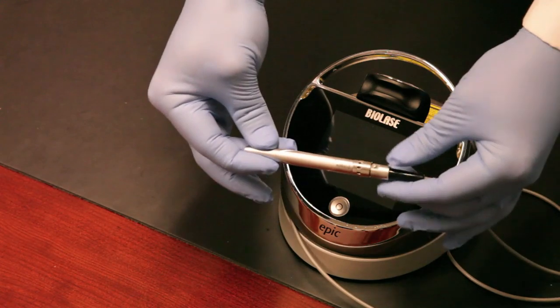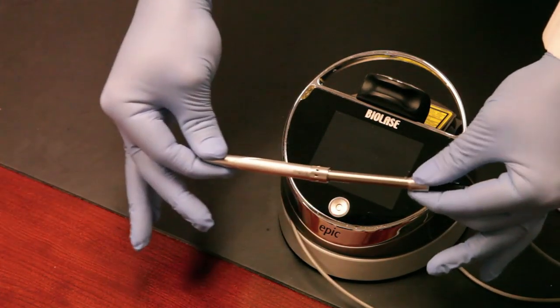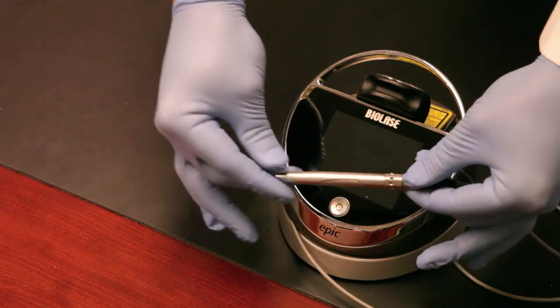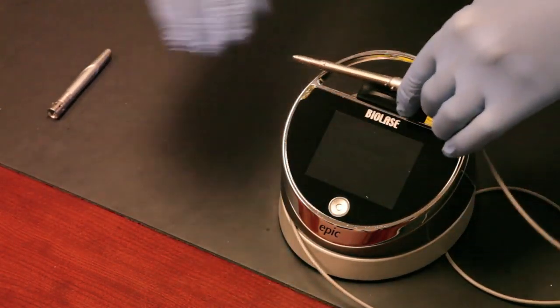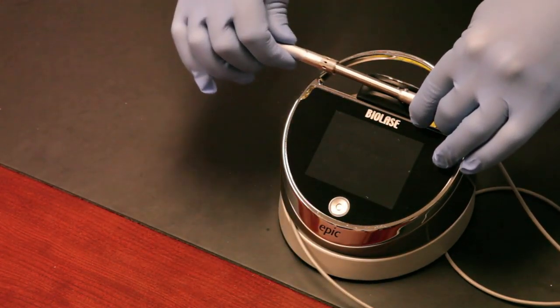To remove the handpiece or install it, there are two little buttons — you can see it slides right off. Put it on, squeeze the two buttons, and off it comes. This is what you'll autoclave, and you'll wipe the fiber end down after use. Very easy to take down and set up.